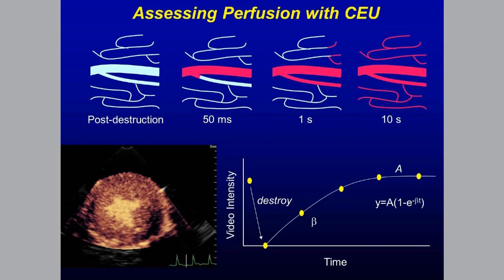Monet, there is a question for us, having discussed using contrast agents during pregnancy. Are there any posted age restrictions for pediatric age groups? What's really nice is that several pediatric groups have been interested in using contrast ultrasound as a research technique to study, for example, right ventricular myocardial perfusion in congenital heart disease, and for other interesting applications in pediatric populations. They have done some very nice studies looking at the safety of contrast agents in kids. And thus far, as I know, there has been absolutely no safety signal whatsoever.